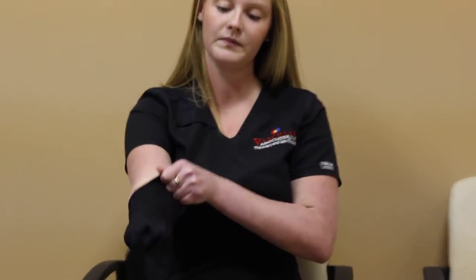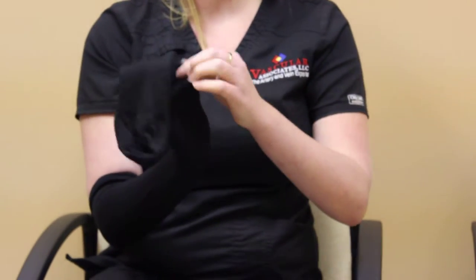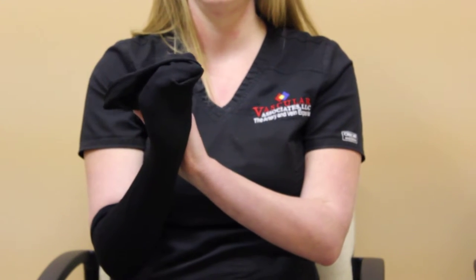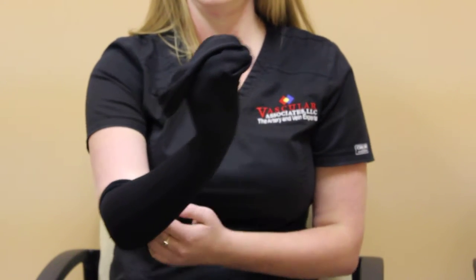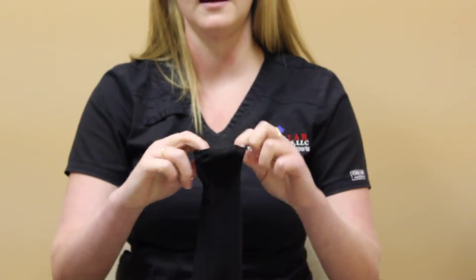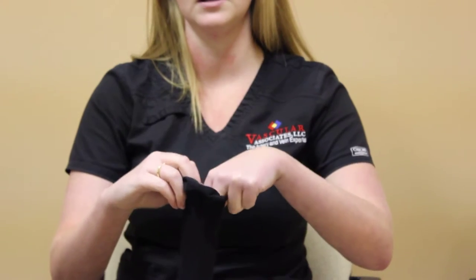When putting on your compression socks, you're going to reach inside, grab the heel, and flip it. It kind of makes a little sock puppet. You're going to flip the rest inside out so that your heel is now on the outside and the foot is tucked in.